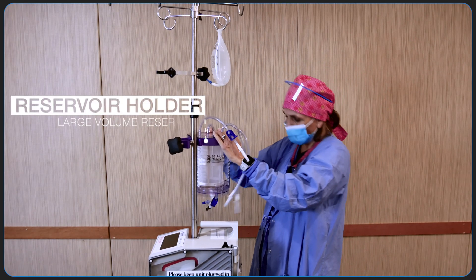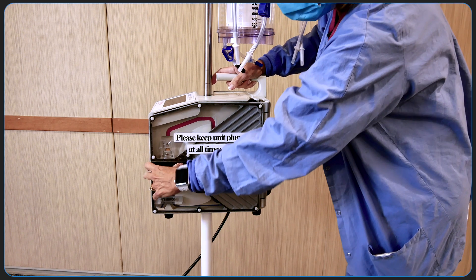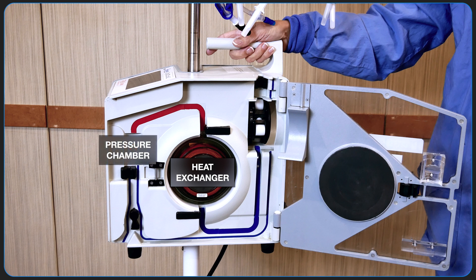The reservoir is then dropped into the large reservoir holder. To install the disposable set, first open the Belmont door. There are 3 primary components that the circuitry needs to be aligned with: the heat exchanger, pressure chamber, and fluid out detector.